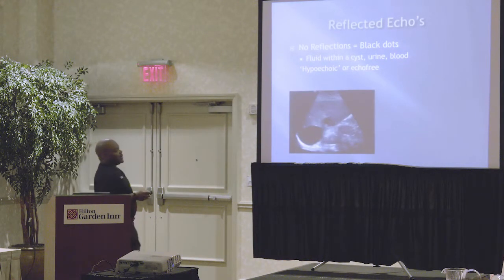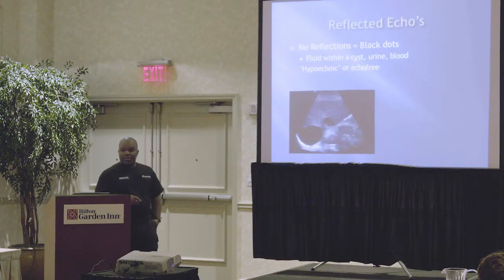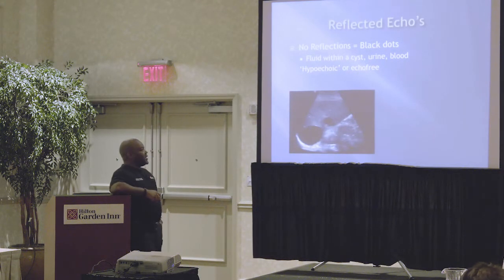So there we are. As you can see here, all right, there's a solid organ, there's a transducer here, all right? This is a nice cystic structure with something in it. All right, depends on where you are. So if this is the kidney, which it isn't, but if it were the kidney, one could say this is probably a cystic structure, all right? If this were the neck, one would say this is a blood vessel. It all depends on where you are and what you're looking at, okay? You have one structure there, another structure there, all right? And you have different shades of structure in here. So if you were looking, for example, at clotted blood, this is what it would look like. And if you're looking at fresh blood, that's what it would look like. Does that make sense?